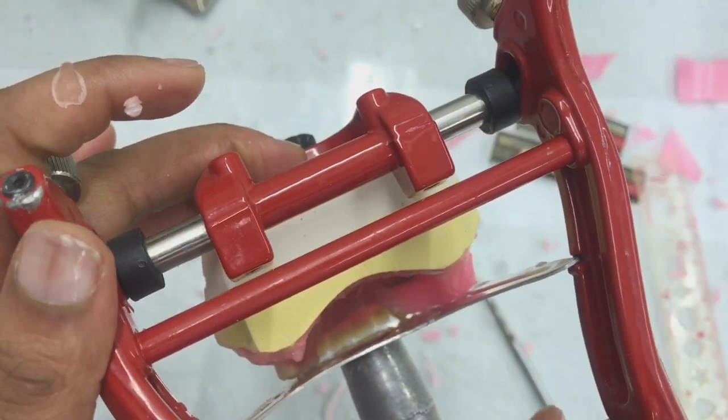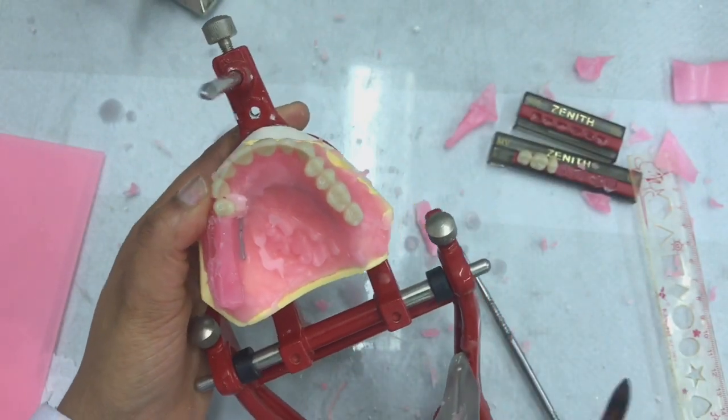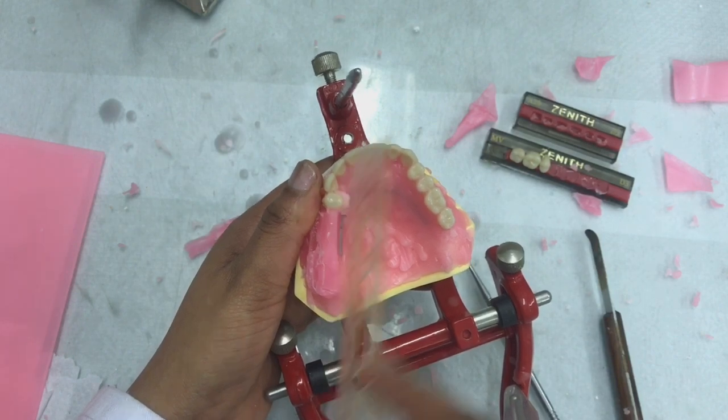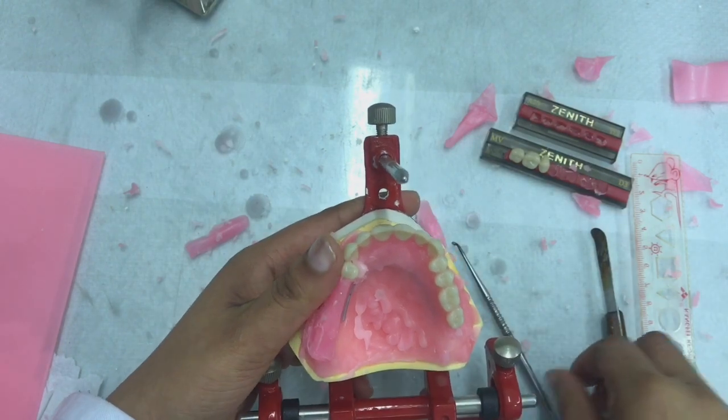The cusp of the premolar is actually off the table, so I don't really have to worry about lifting it up. So now the only thing that I have to double check is that the position of my tooth is actually still fine. So it looks perfect.